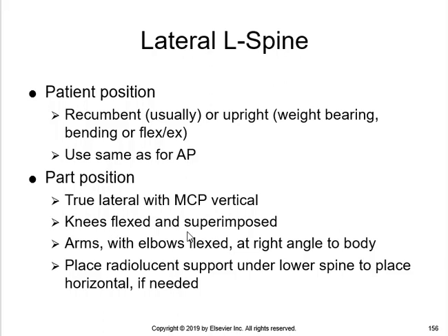Bend the patient's knees and flex their knees and put them in front of them, again, as if the patient's going to sleep. Put their arms out in front of them. Make sure their shoulders are stacked. Make sure their pelvis is truly lateral. Make sure their knees are on top of each other.